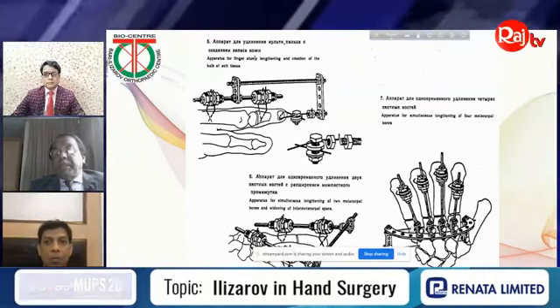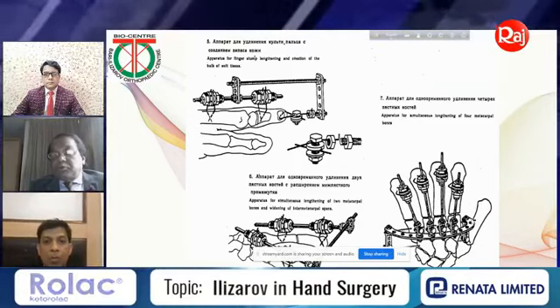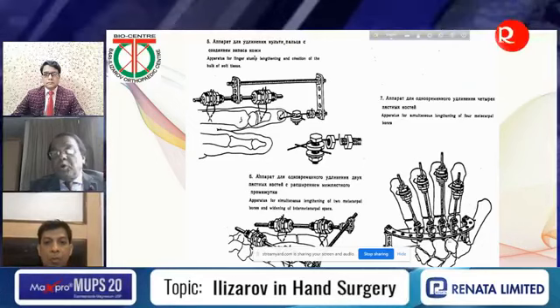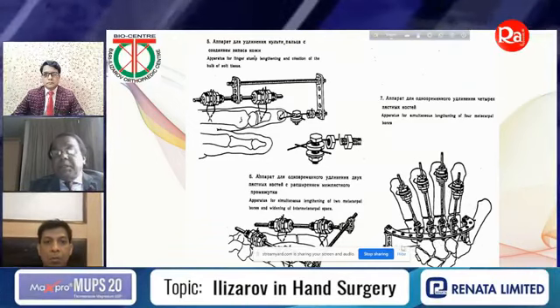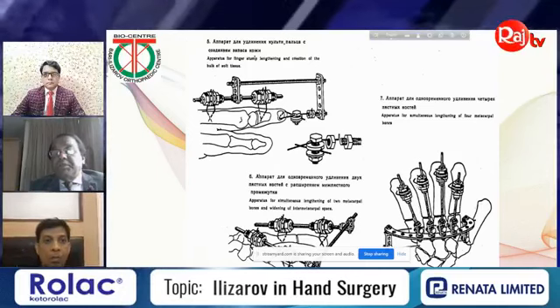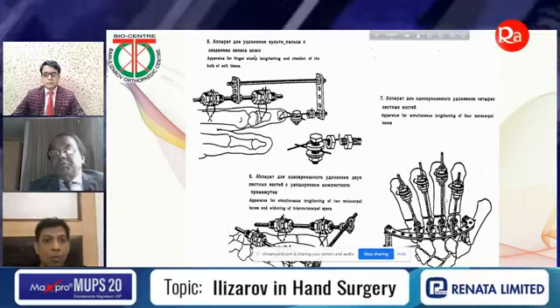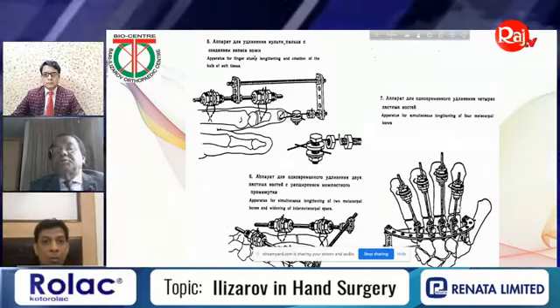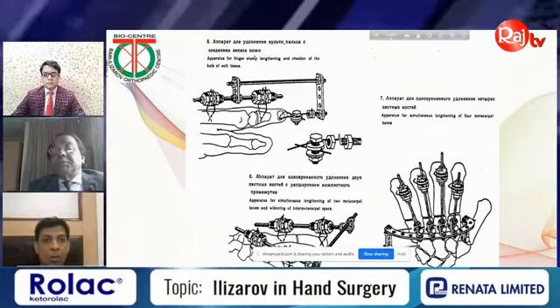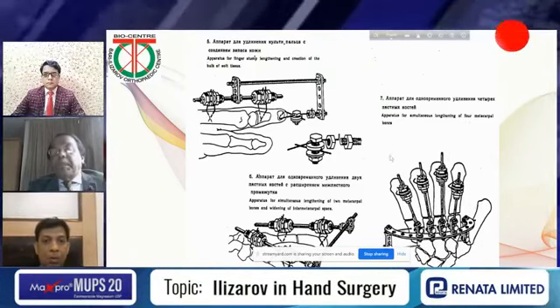If you want to go for lengthening, you can see you just put an arch. This is called bow, small bow, and then here you can fix it with the post, and then mini fixator. These rods are very small, 3 times smaller than the normal rods. So this is apparatus for simultaneous lengthening of the 4 metacarpal bones.